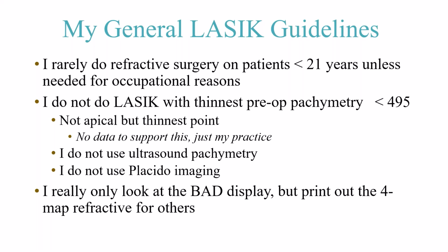I have not used ultrasound pachymetry for God knows how long, probably 20 years. I've also not used Placido imaging for over 25 years. I actually started using elevation back in the 80s on a machine that's no longer clinically available. So it's been about 40 years since I've actually used the Placido device. I really rely on the BAD display. I tend to print out the standard refractive display just because people are used to seeing it, but 95% of the time I'm really just looking at the BAD display.